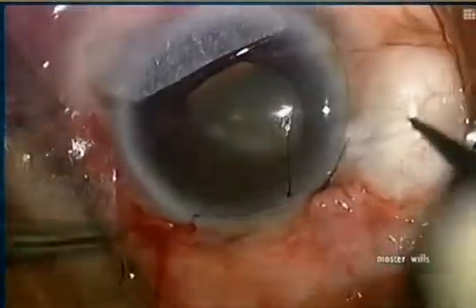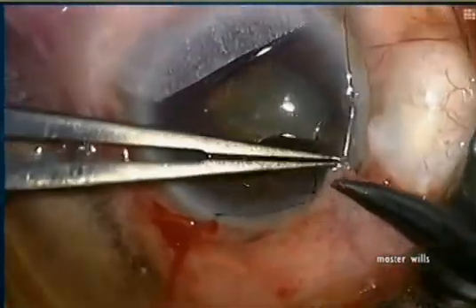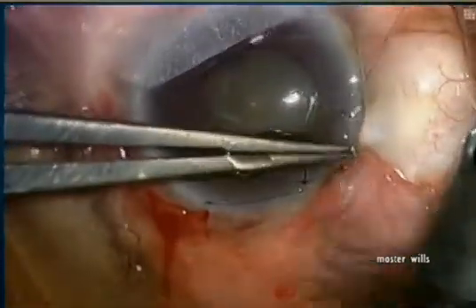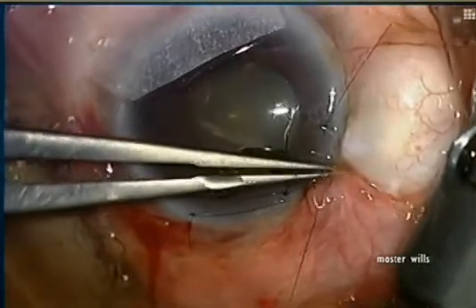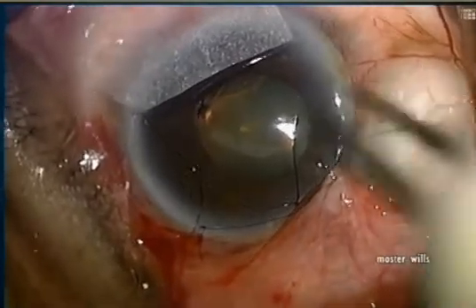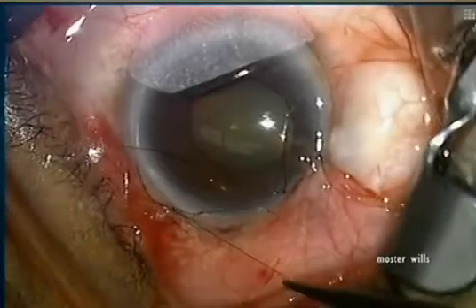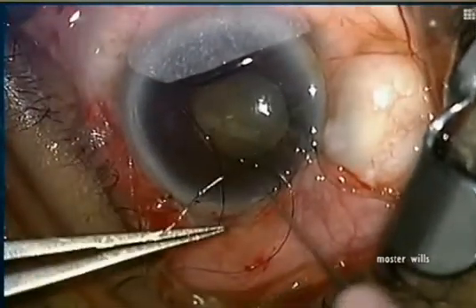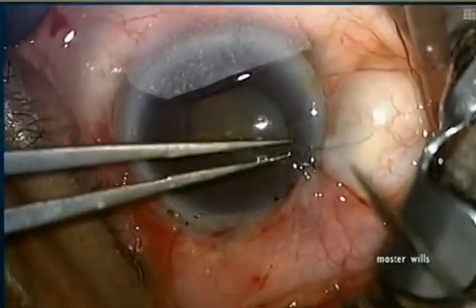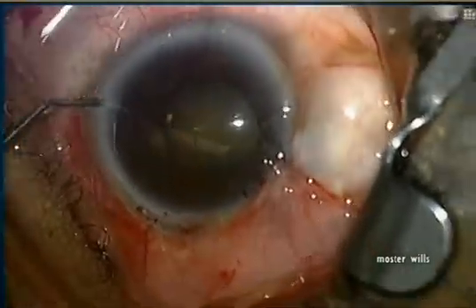Because we're near the old bleb, I don't want a dellen to form, so we put in one extra suture for an even plane for the tear film so there will not be dellen formation between the old surgery and the new. Notice we only use about two and a half clock hours of conjunctiva, which is why this surgery is so useful in either the temporal or nasal direction — you only need a small amount of mobile conjunctiva. We also cut the releasable sutures once we see where the fornix-based flap will reside.